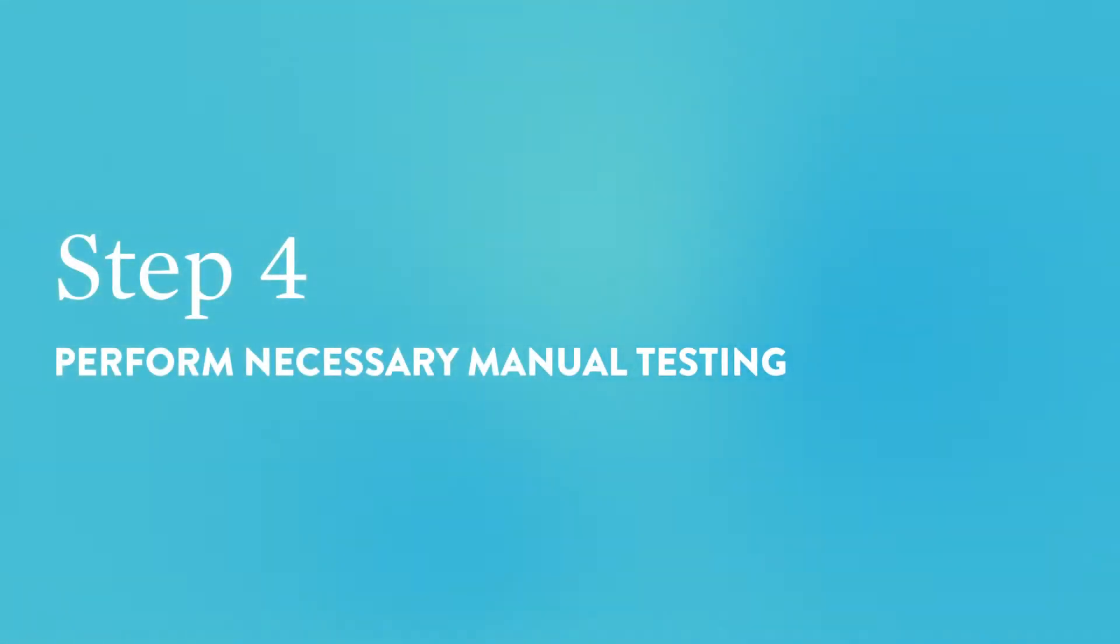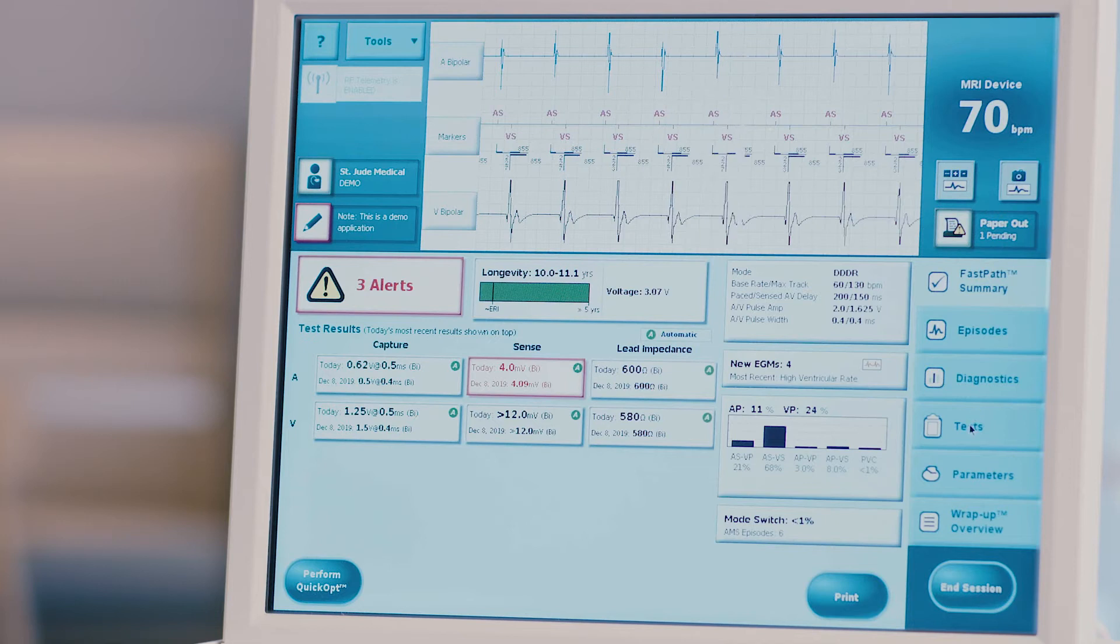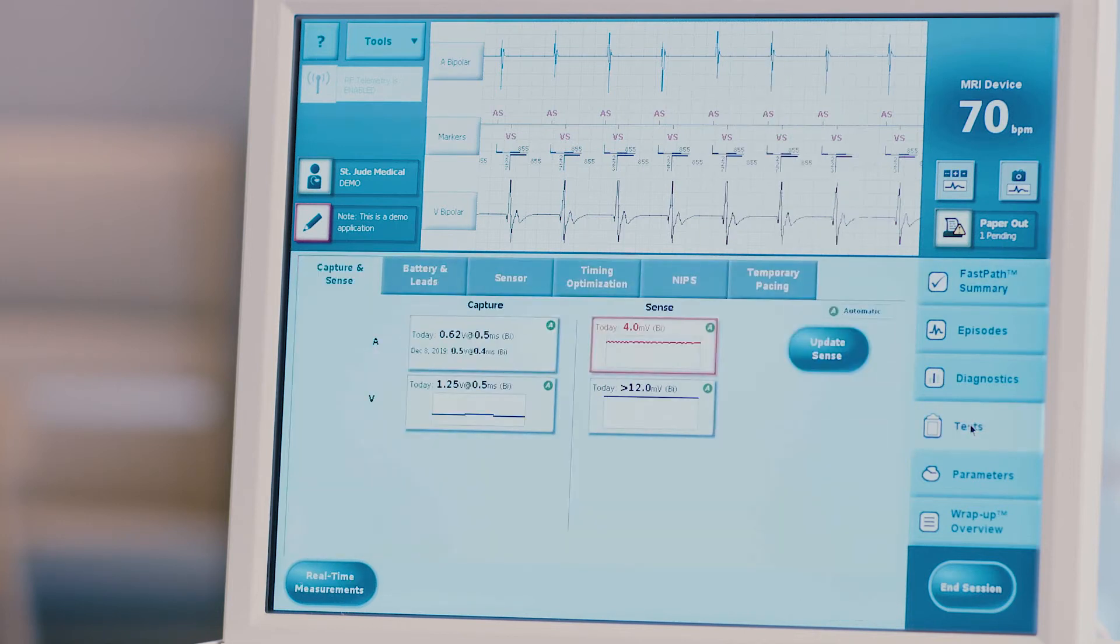Step 4: Perform necessary manual testing. Only do this in the presence of a healthcare provider or certified Abbott employee. Press the test tab on the right side of the screen. The capture and sense tab will open first.